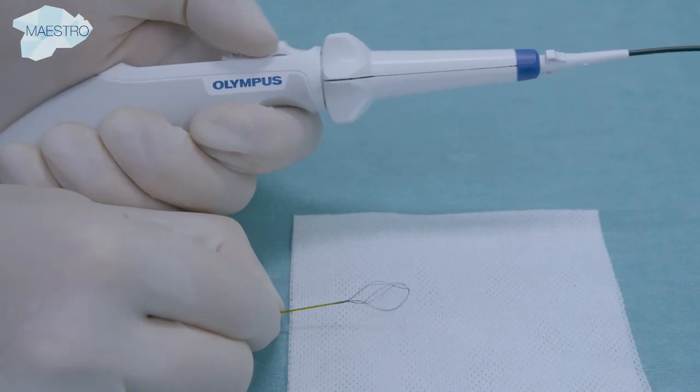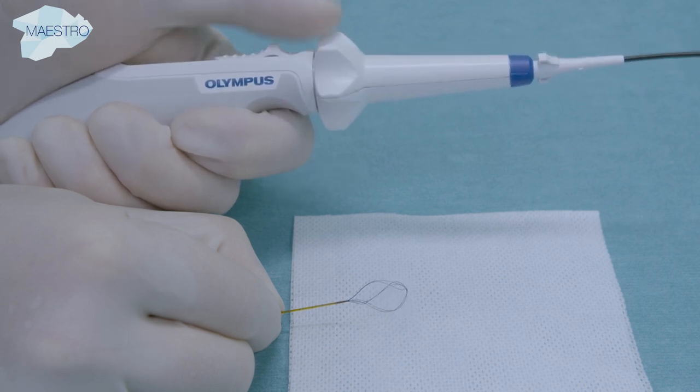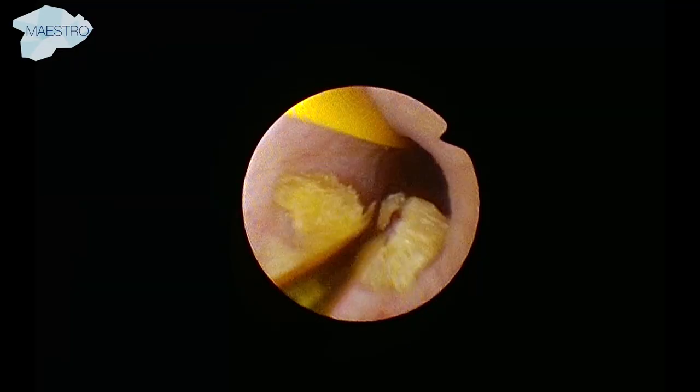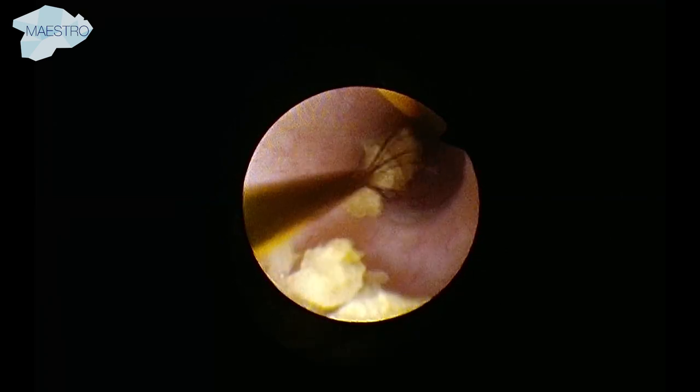A tipless basket design is essential to efficiently capture caliceal stones. For multiple small fragments in the kidney or ureter, a 6-wire basket is used. Catching several pieces at once reduces the number of scope passages and operating time.